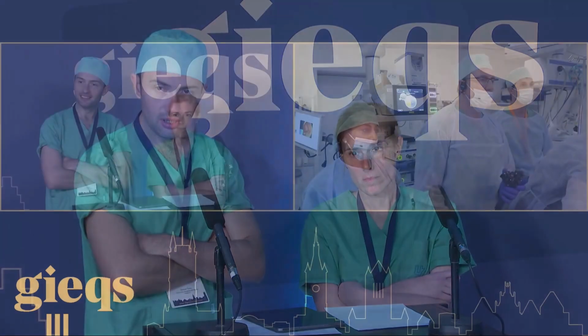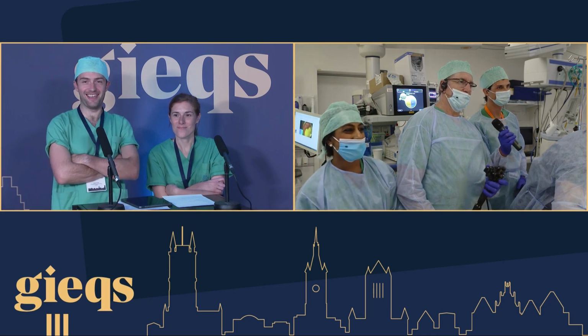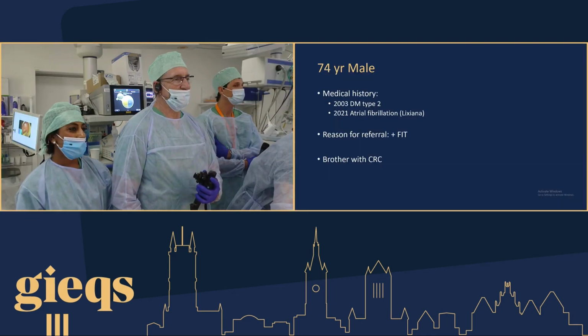Thank you. Well, let's move right into Michael there. Apparently mushrooms are in season. Very nice. Show us the lesion. I saw it. It's quite small. Okay.